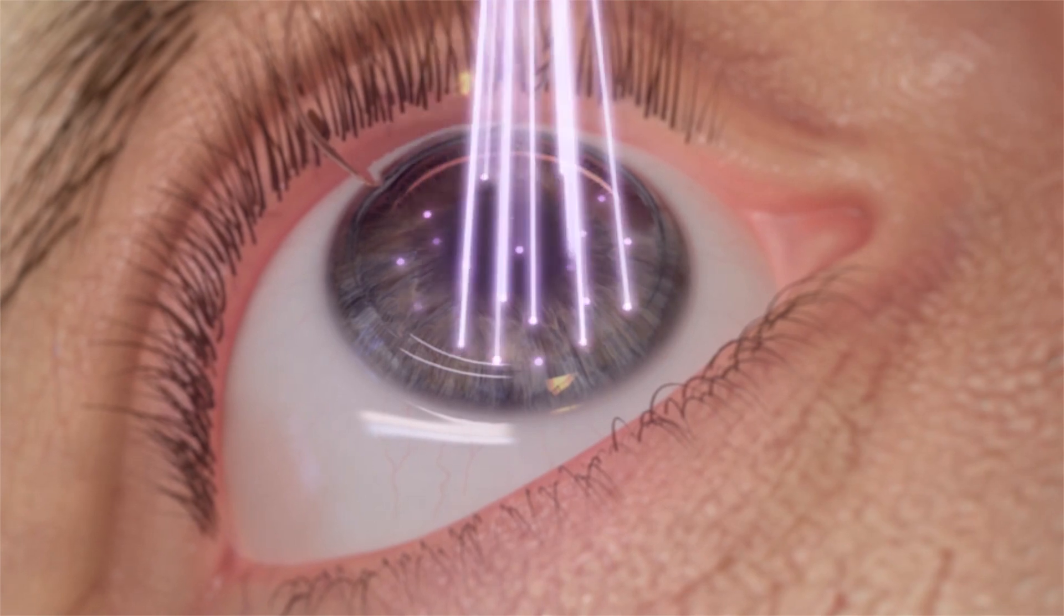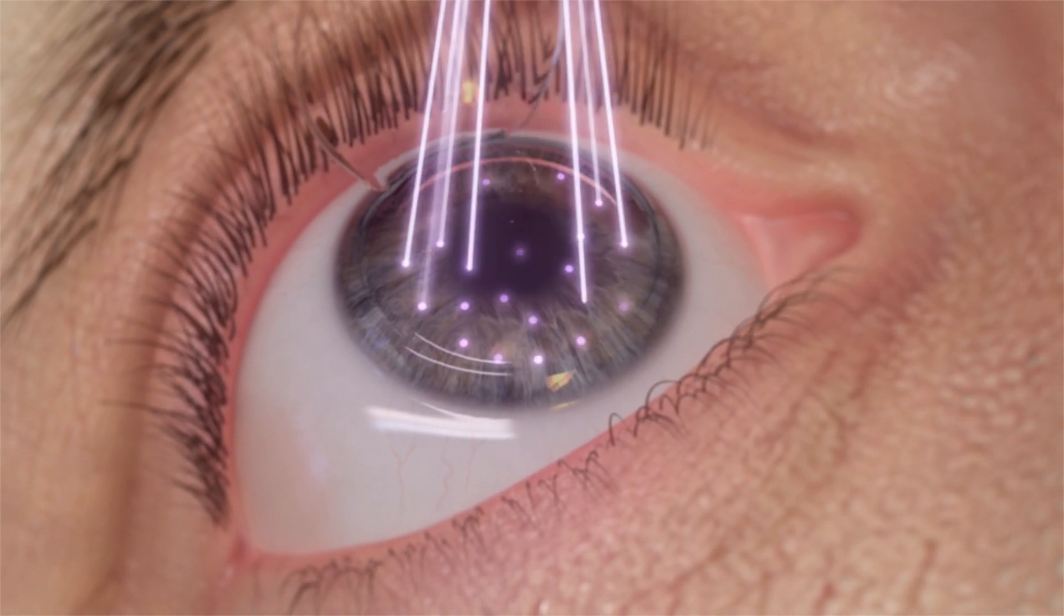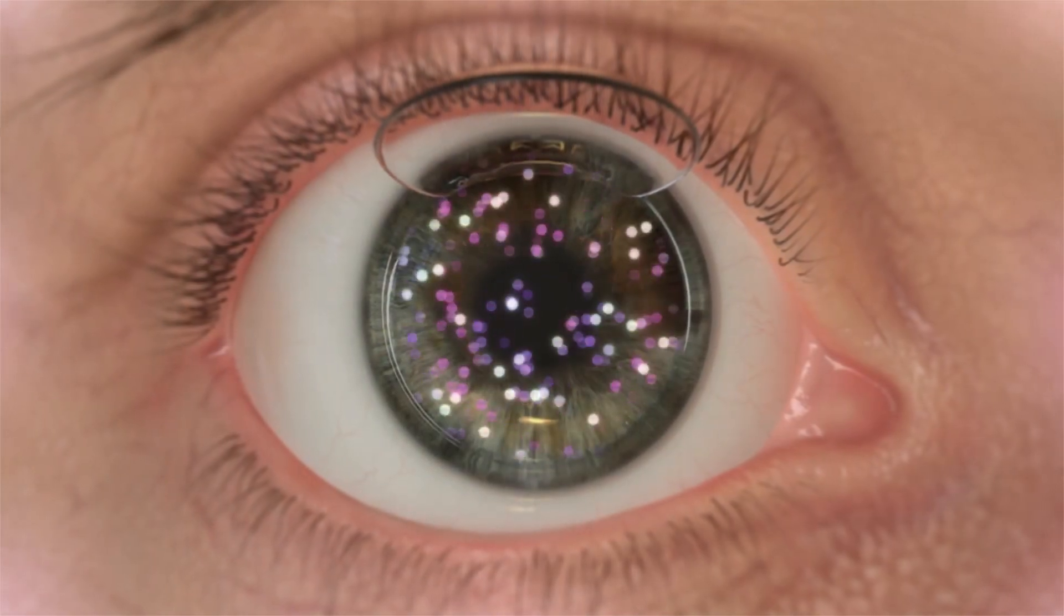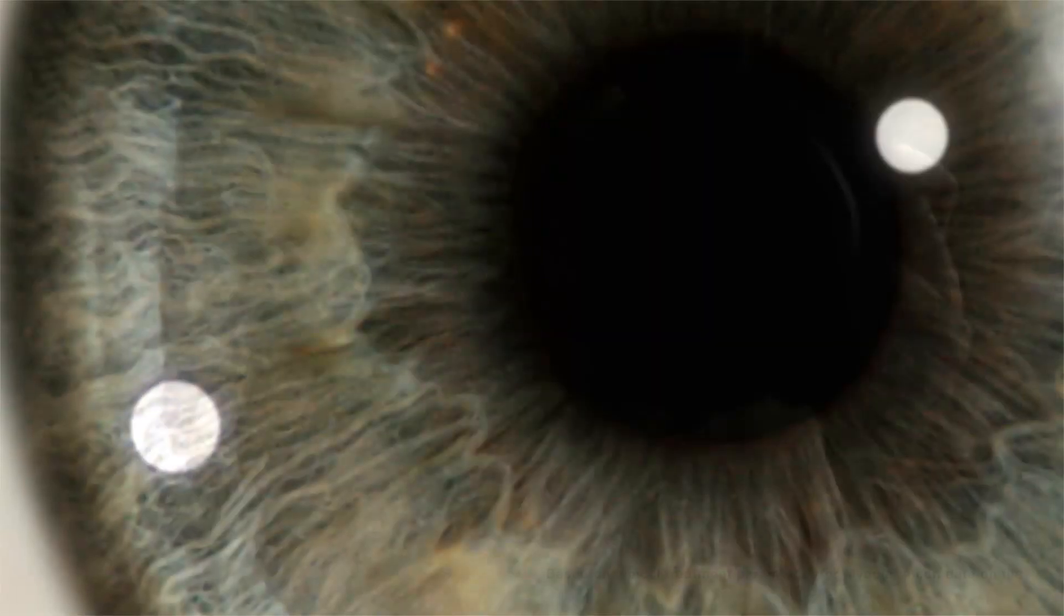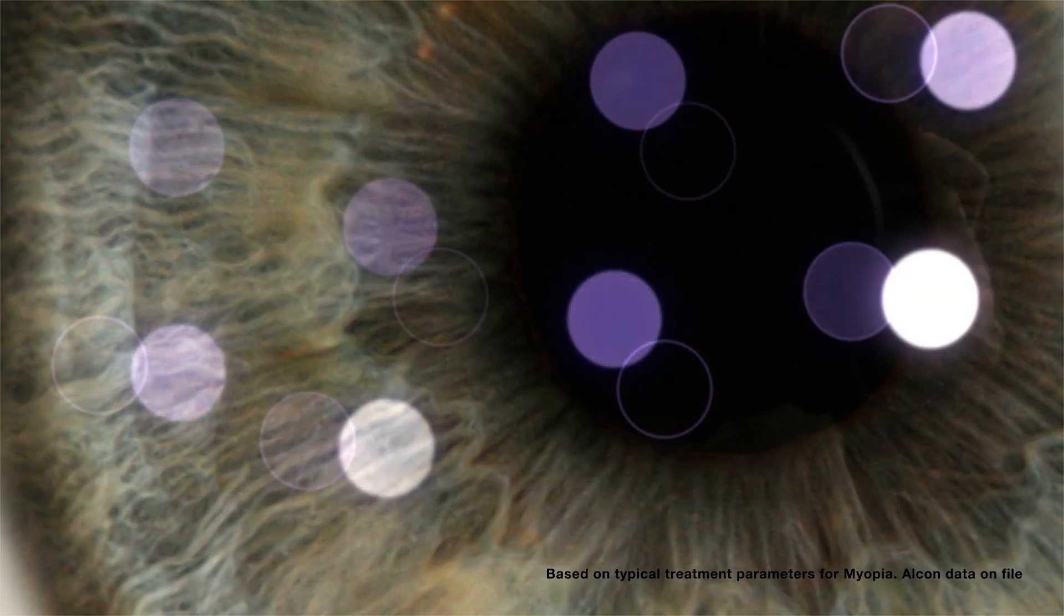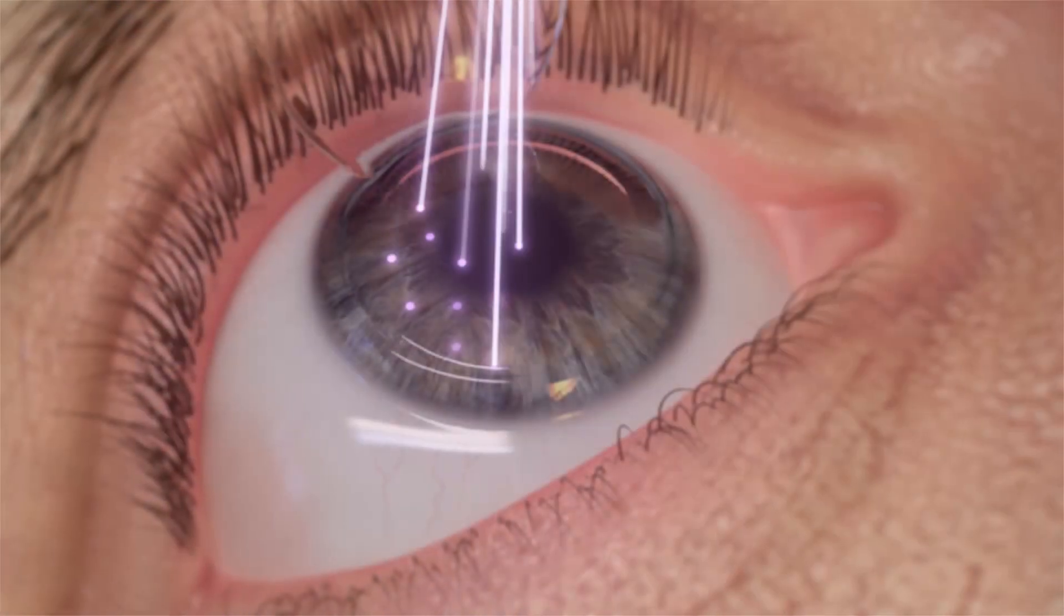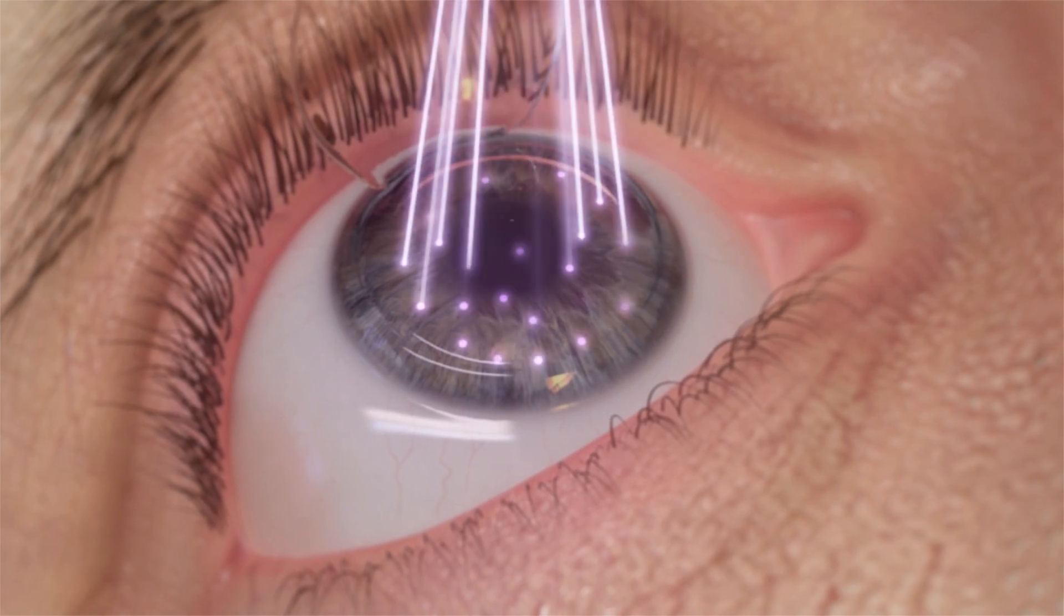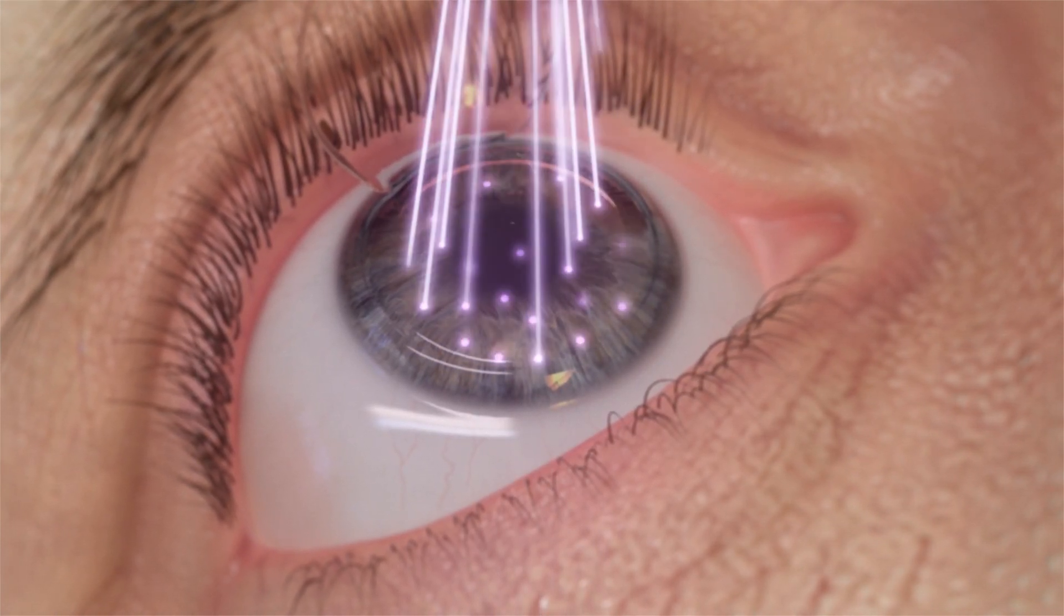The Wavelight EX500 excimer laser maintains a high pulse frequency with minimized thermal load, allowing only one in five pulses to overlap. This allows the treated area of the eye to cool before receiving additional pulses. This treatment algorithm provides an approximate treatment rate of 1.4 seconds per diopter.